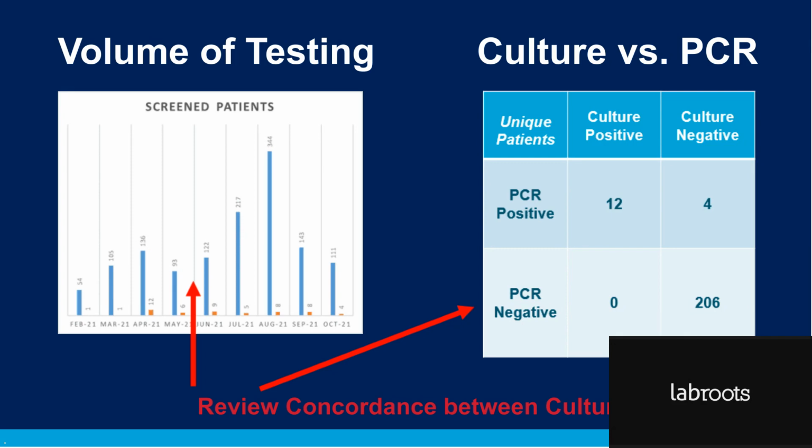And we were able to confirm that these cases were actually true positives based on their history or subsequent cultures that were then positive. On the other hand, the culture was not really identifying any additional positives. There were 0 that were PCR negative and culture positive.